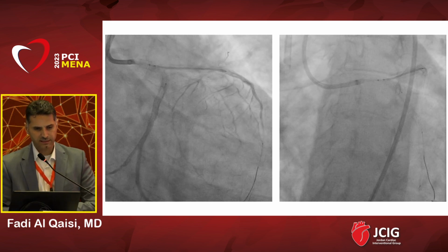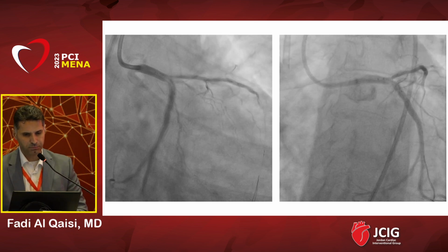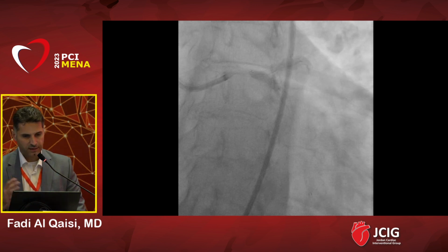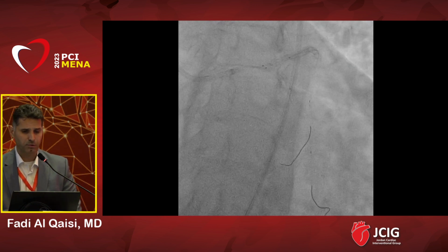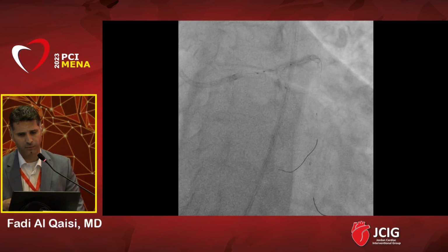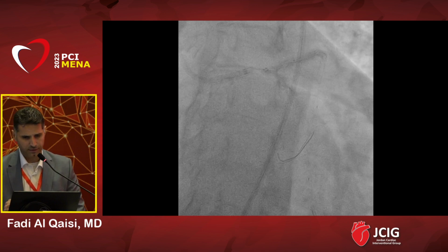This is the LAD stent placed covering the ostium, protruding into the left main, and you can appreciate that's a 2.75 by 38 stent with the 3.5 by 15 millimeter balloon parked in the left circ. The stent was deployed. We checked. We like the stent. Patency is good. We pulled the wire. We crushed it with the balloon.